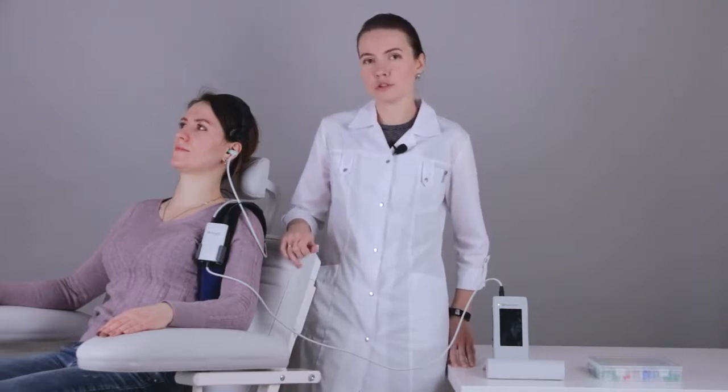Now we have finished the acoustic reflex threshold estimation, and we are ready to go to the acoustic reflex decay procedure. It allows us to evaluate the functional state of the retrocochlear portion of the auditory system.